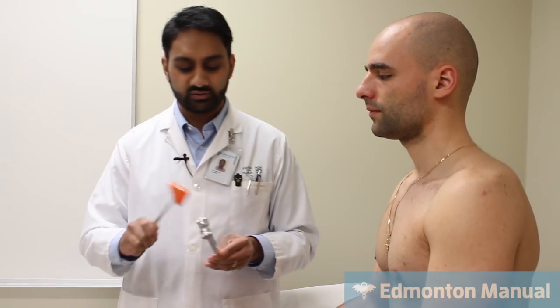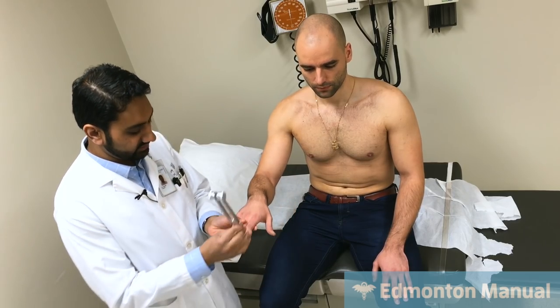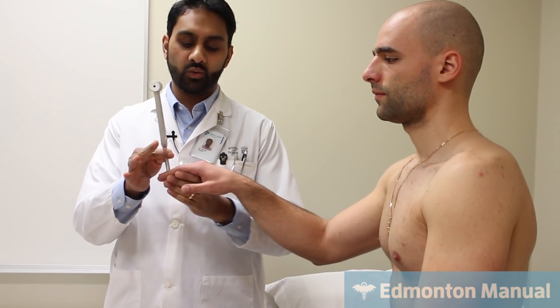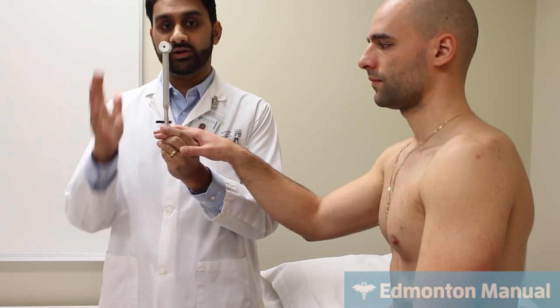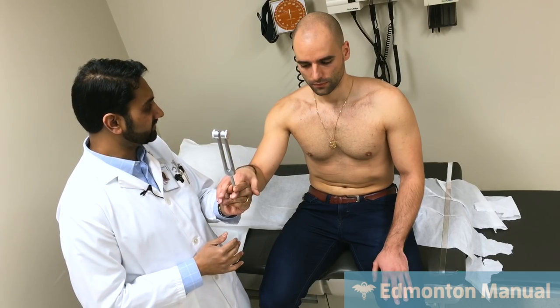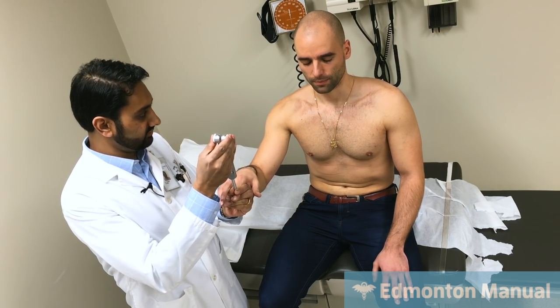So what we're going to do, again, is hit it. Please lift your hand up, and I'm going to put this on here. There's a variety of ways you can actually hold this. One of the ways I find works is stabilizing both the hand and the tuning fork, allowing this hand to be free. And the reason is I can then say, please close your eyes and tell me when you feel it stop. Stop. Okay. And that allows you to do that.